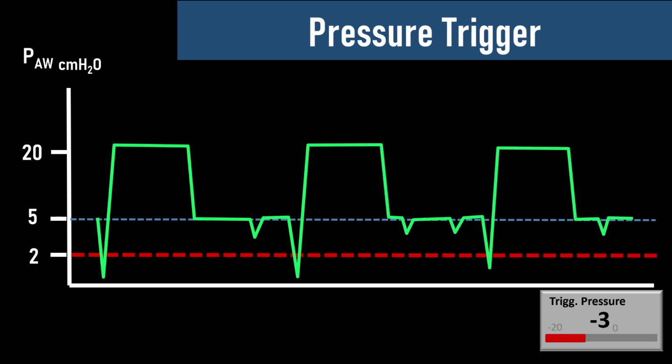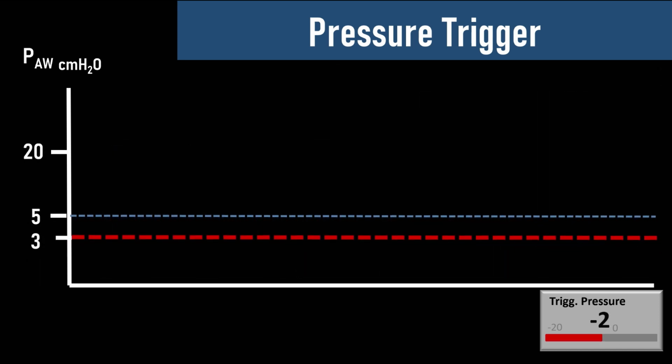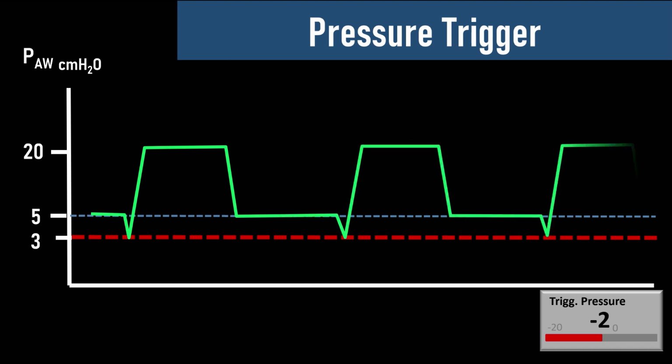Well, the patient here is clearly gasping and getting a few breaths, but there are lots of breaths being missed and the patient is very uncomfortable. They will look dyssynchronous with the ventilator and get all purple-faced, and people will start loading up syringes of sedation. Not good. All you need to do is move along and push up that negative pressure trigger to -2 and let's see what happens. And now we have a happy patient.